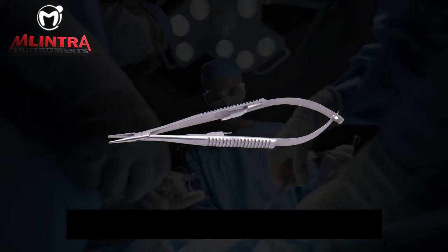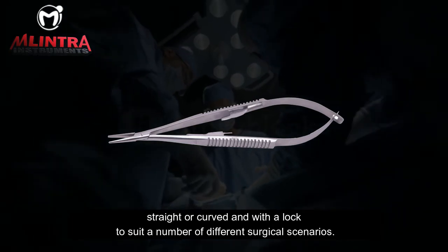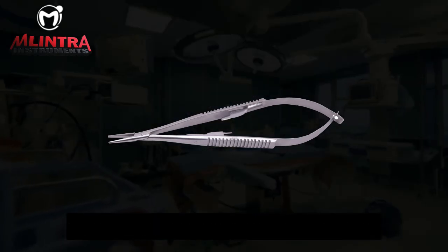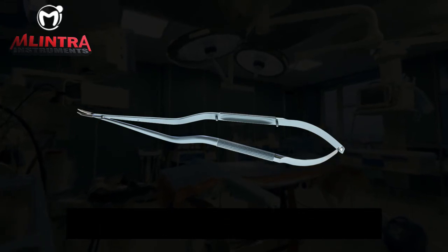This holder is available either straight or curved, and with a lock, to suit a number of different surgical scenarios. It is available in different sizes: 10 cm, 12 cm, 14 cm, and 18 cm.